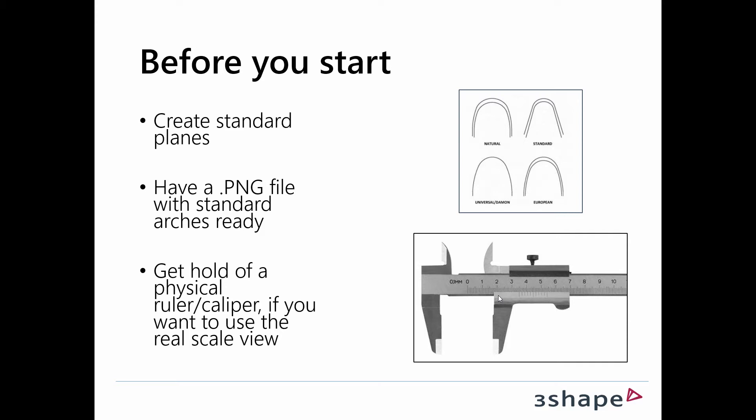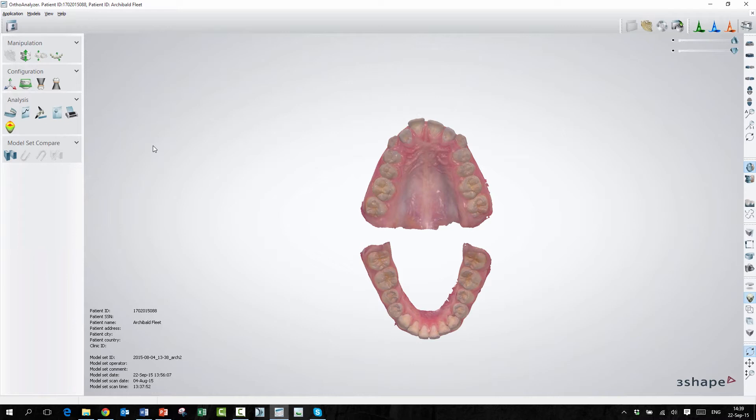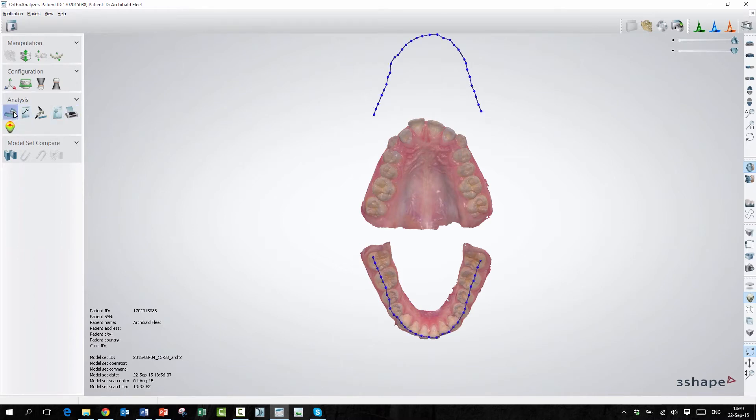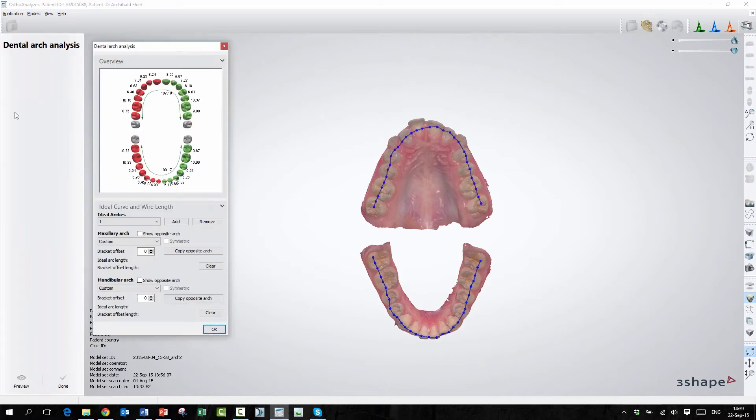Let's go into AutoAnalyzer and see how the dental arch analysis works. So we are now in AutoAnalyzer. Rikke, tell us how the dental arch analysis works. We'll start with finding the icon over here, which is this one, and we'll just press it and it will open up.